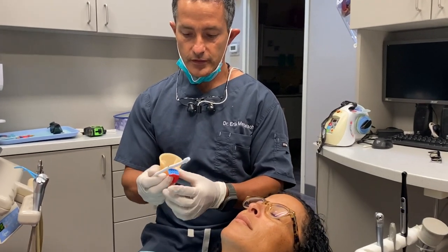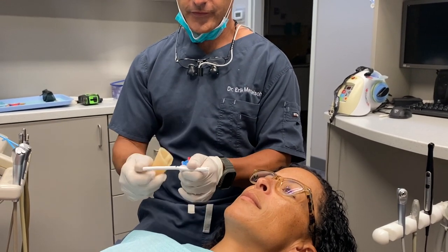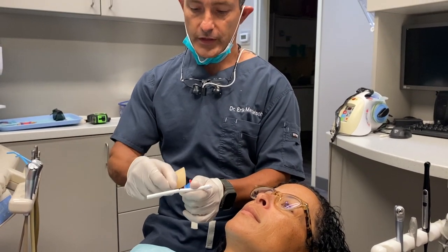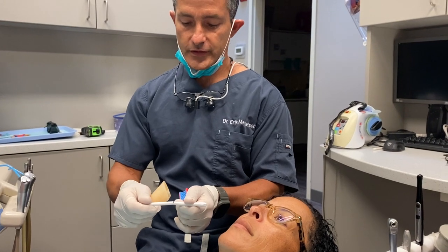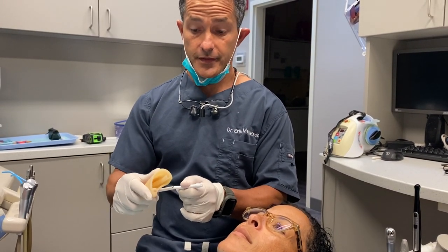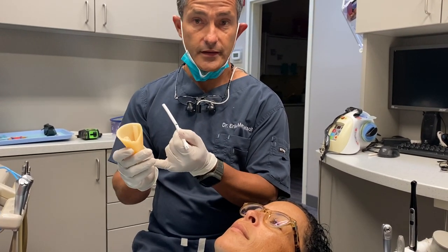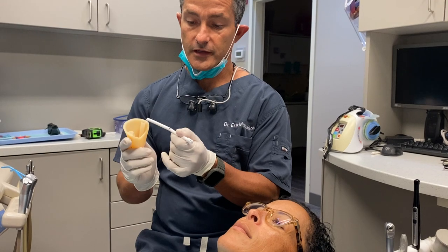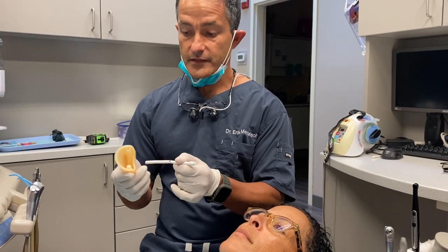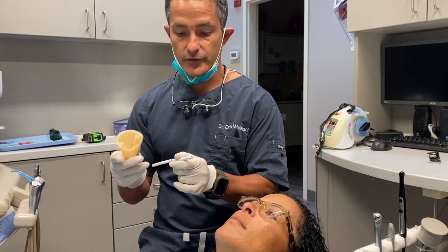So we have our e-block saliva ejector that's cut to exactly five inches, and right at the middle there's a two and a half inch mark. That's going to give us the ideal depth that we're going to want to insert the saliva ejector, so we're not blocking the main suction and we're getting maximum suction. We can always come out a little bit or in a little bit to increase or titrate that level.